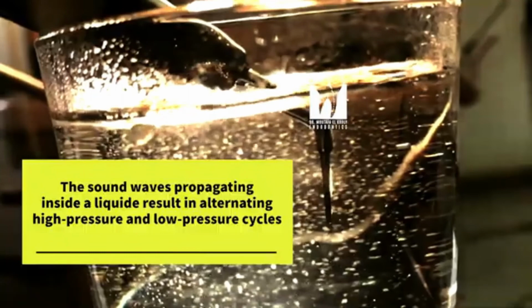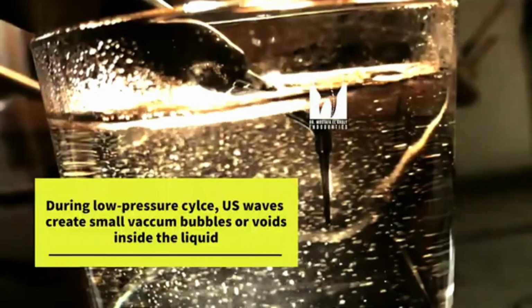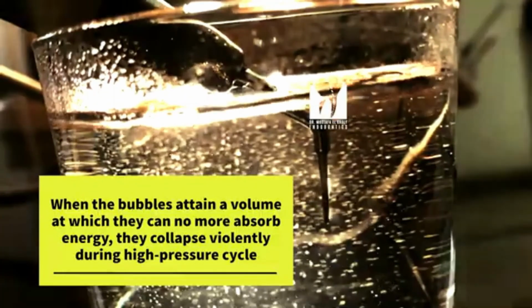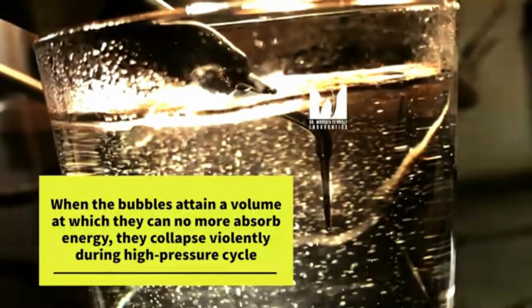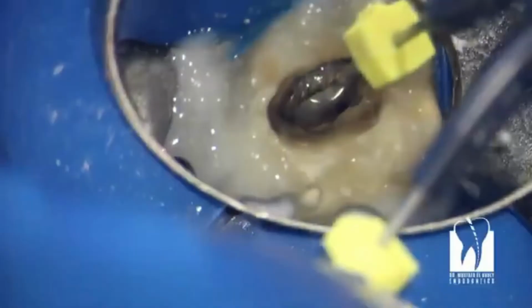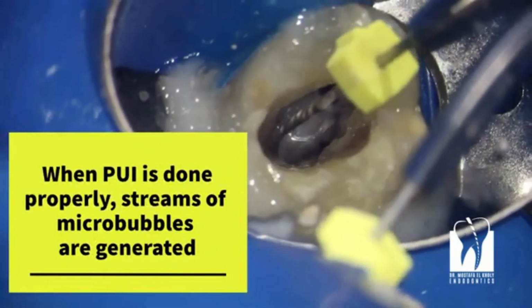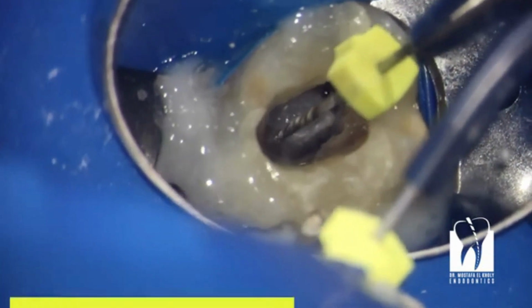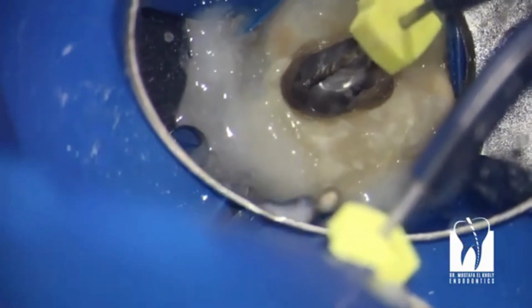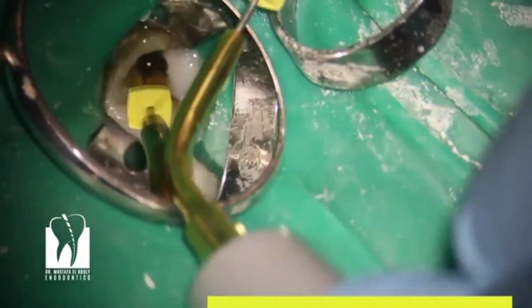What are the uses of endosonics? The use of round or taper ultrasonic tips has been shown to produce a smoother shape of the access cavity. Ultrasonic instruments are useful in the removal of chamber calcification. Acoustic streaming forces the irrigants together with the oscillation of the instrument. They are useful for dislodging debris out of the canal. Low power ultrasonic can be used to vibrate the material into position.